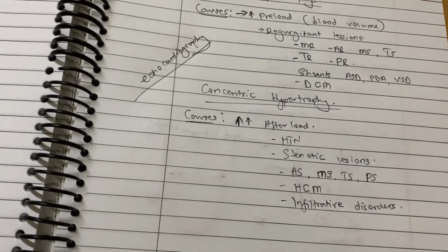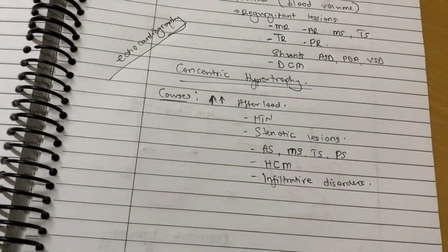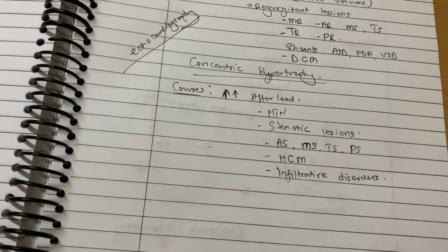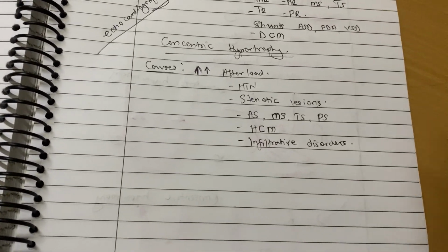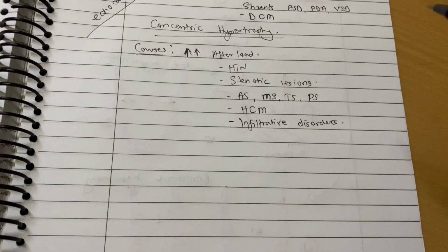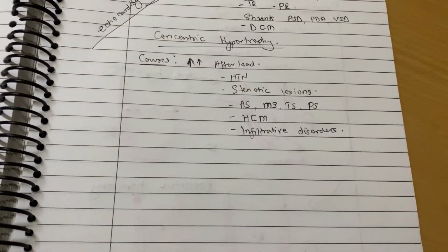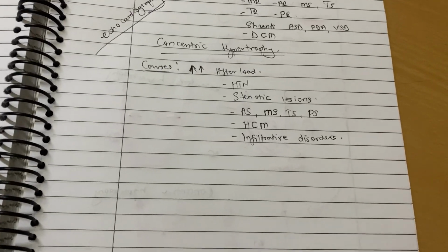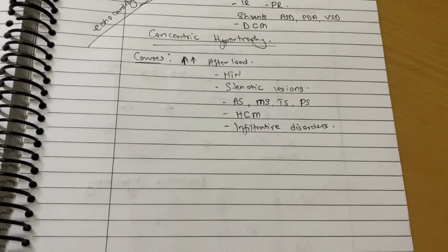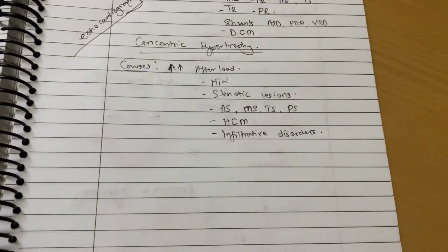If the ECG doesn't show anything like hypertrophy, then the measurements are taken, but we may not pay attention to them because the ECG has not shown it. But if the ECG is showing it, then we have to pay extra attention to find out whether it is really there or it is a false positive.